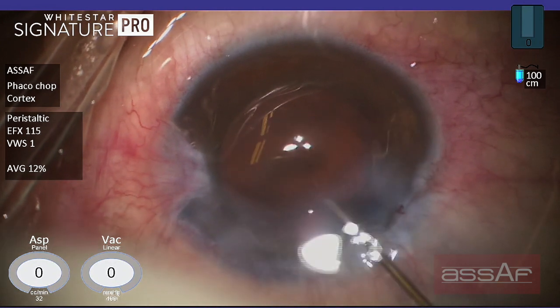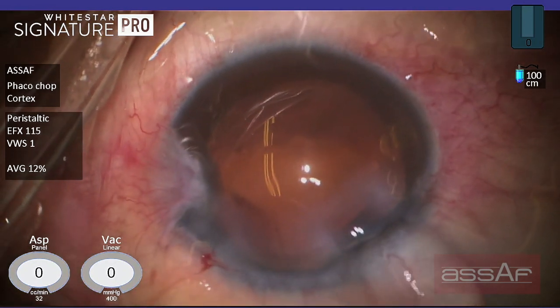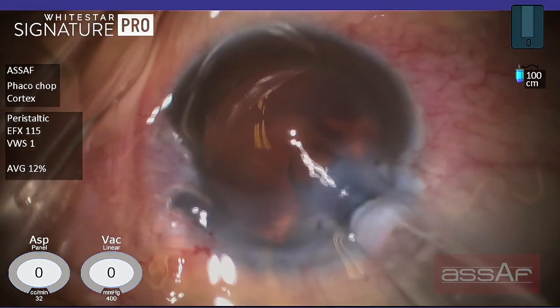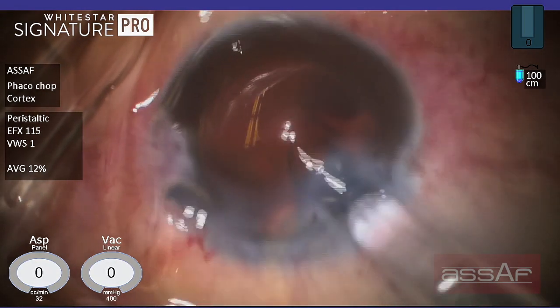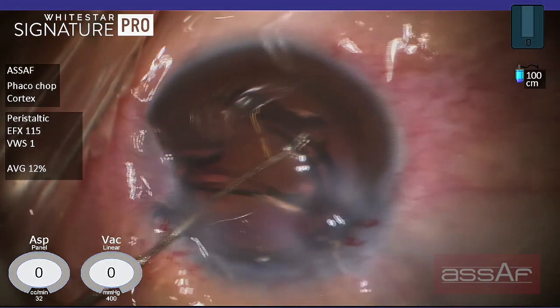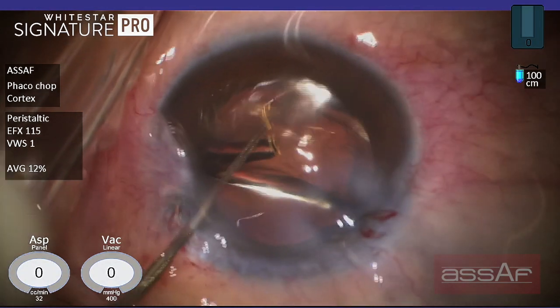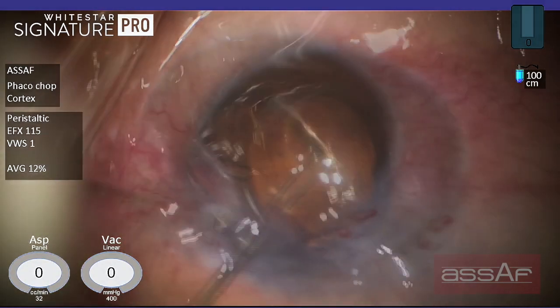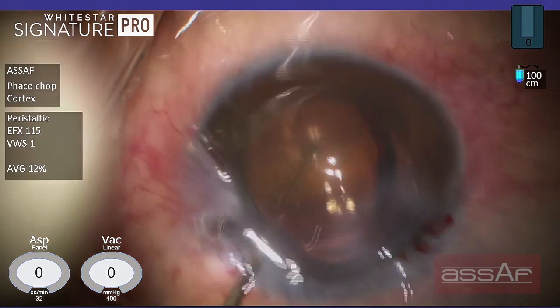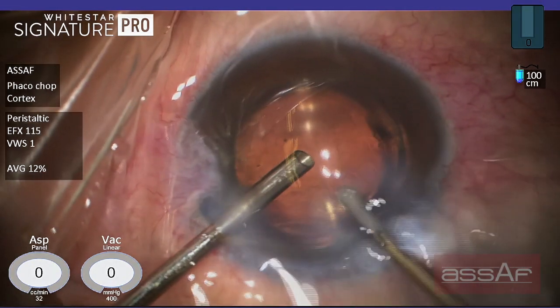Injection of cohesive OVD to fill the capsular bag before implantation of the IOL. A single-piece IOL is being implanted into the capsular bag through a 2.2 millimeter incision. Now waiting for complete unfolding of the lens optic and haptic within the lens capsule. The lens has now been completely unfolded within the capsular bag.